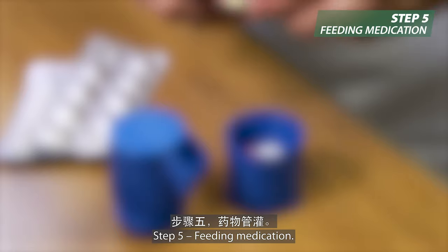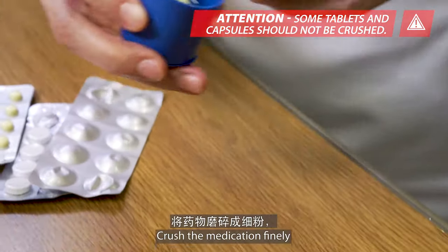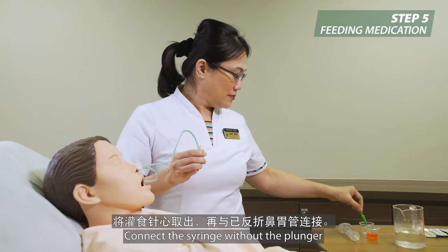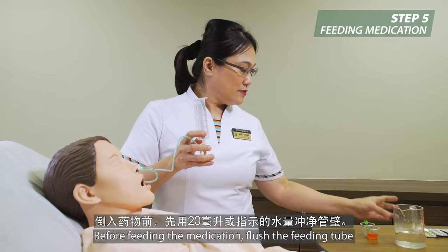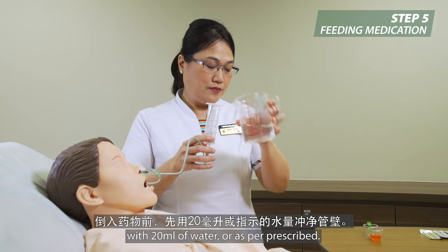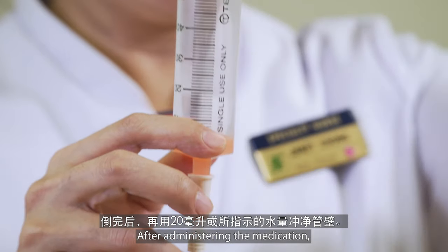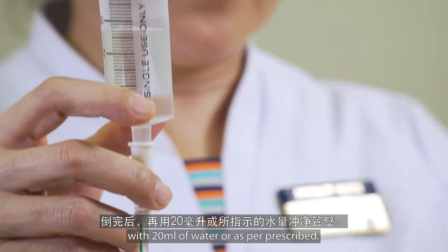Step 5: Feeding medication. Ensure the right medication is being prepared. Crush the medication finely or dissolve the pills in lukewarm water. Connect the syringe without the plunger to the kinked feeding tube. Before feeding the medication, flush the feeding tube with 20 ml of water or as per prescribed. Pour the medication into the syringe. After administering the medication, remember to flush the feeding tube with 20 ml of water or as per prescribed.